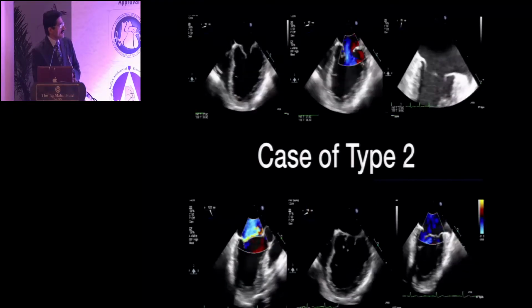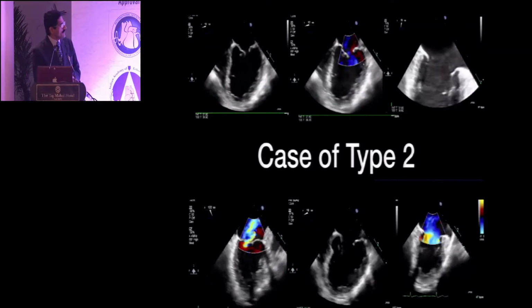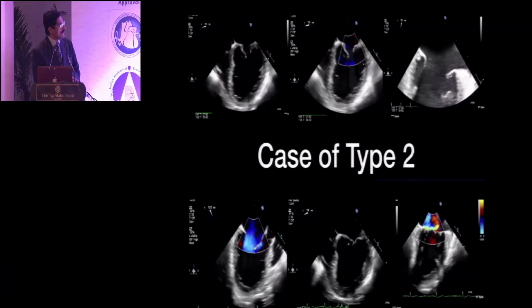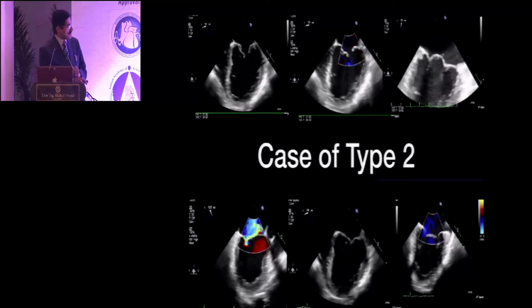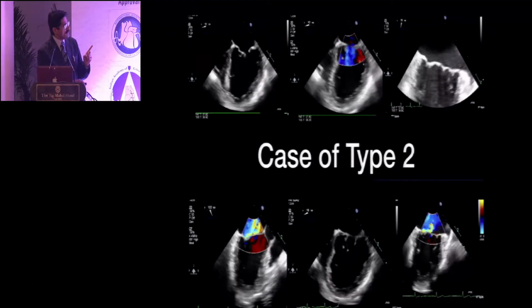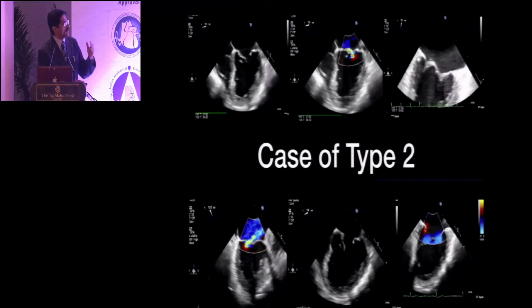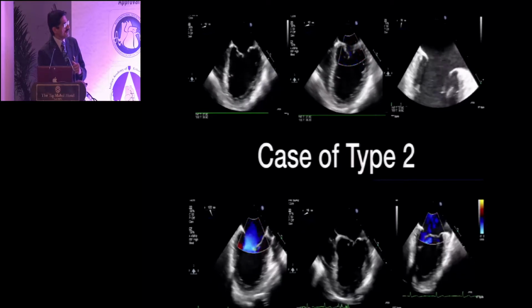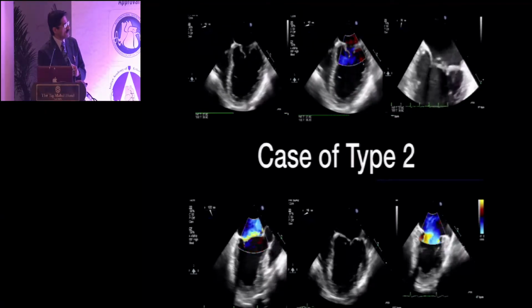We had a very nice case of degenerative valve disease. Intraoperatively, we found something hanging below the anterior mitral leaflet. We were not sure what it was. Color flow showed severe MR. Now on this view, again it is very important, you can see something just coming up and down in the back. See, this is P1, A2, and P3 on the 2D view, but you can see something just going up and down.